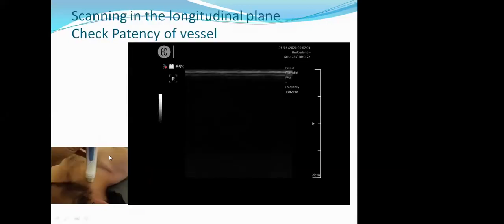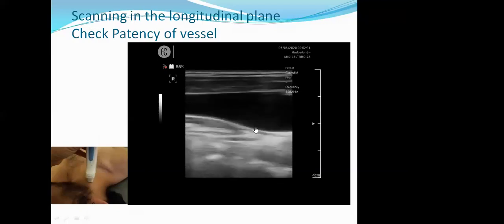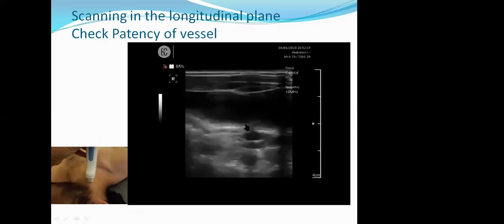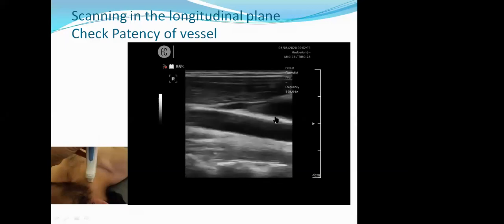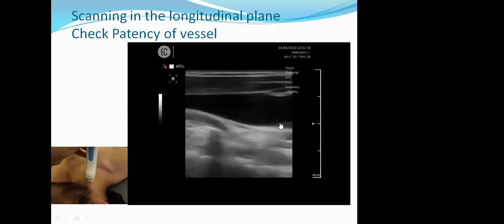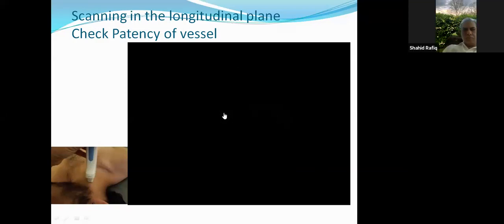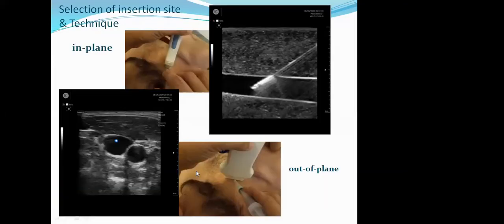Here I have put the probe in a longitudinal direction. Look over here. This is the common carotid artery, and this is the internal jugular vein with thin walls, and you can see the valves. Let me just show you. Yeah, you can see the valves over here. You see this one, and look at the thin walls which are collapsing. So we see both in the transverse plane and in the longitudinal plane.